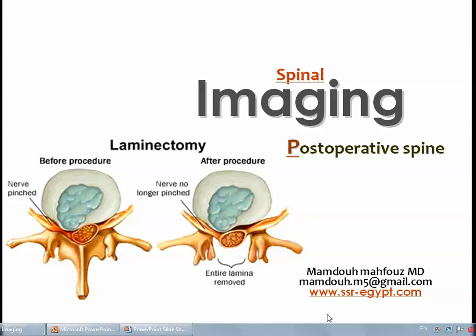Dear colleagues, this is a short lecture about imaging of the post-operative spine. I will explain here, inshallah, some of the important issues about evaluation of the spine in the post-operative days.